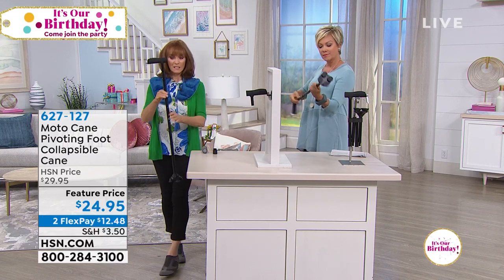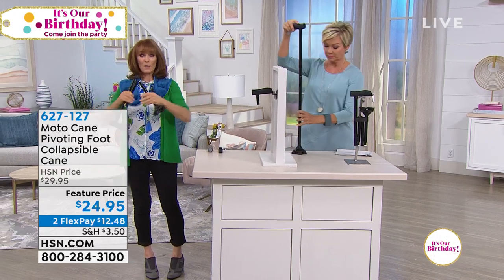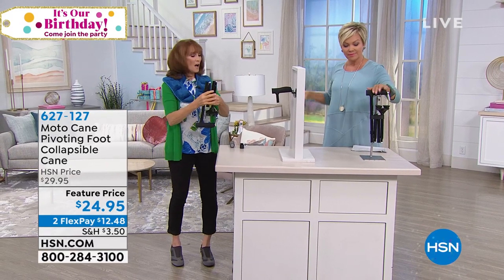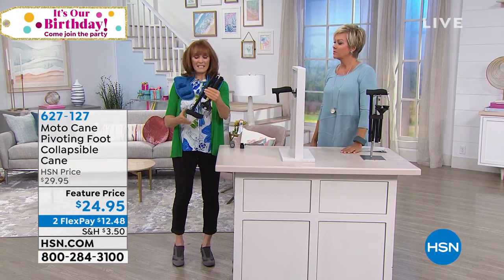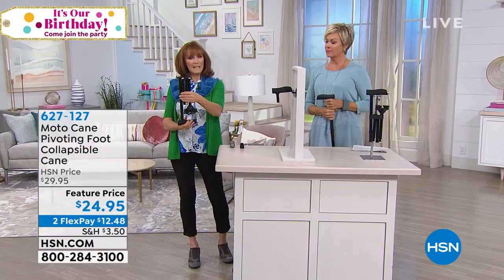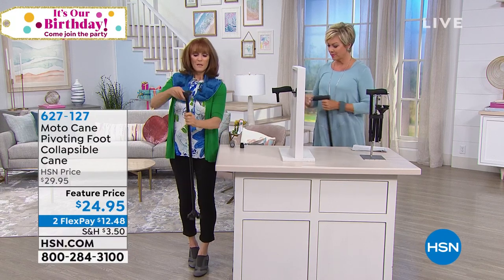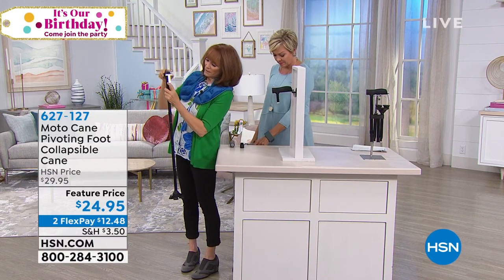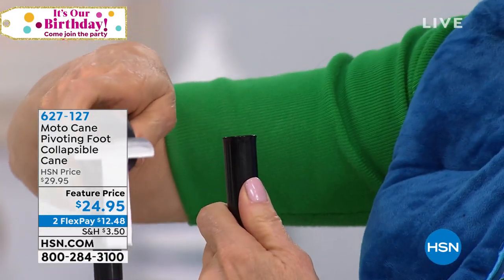It's not just a fabulous cane — it also folds to 12 inches, so storage is not a problem. Taking it to the restaurant, putting it in your bag, putting it in the overhead bin is not a problem. And then when you want it — hang on, because this is cool — it assembles itself. Watch. I'm ready to use it. That's it.